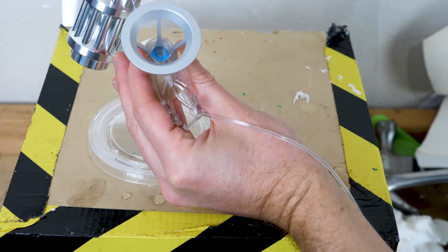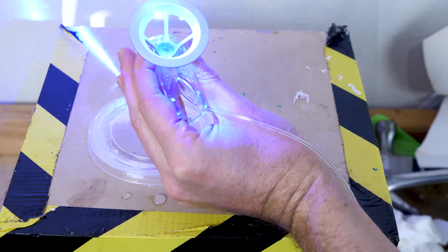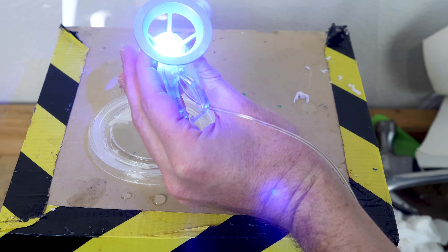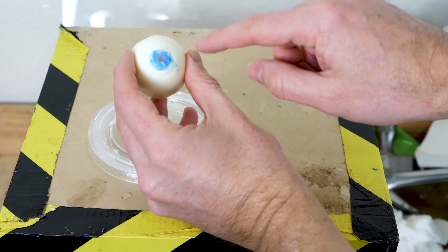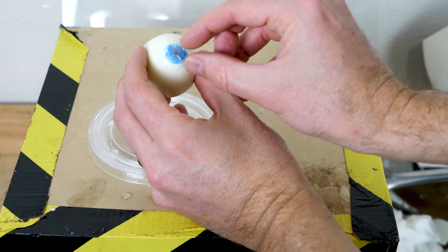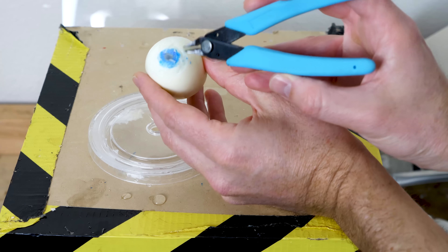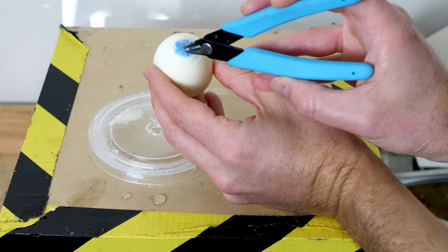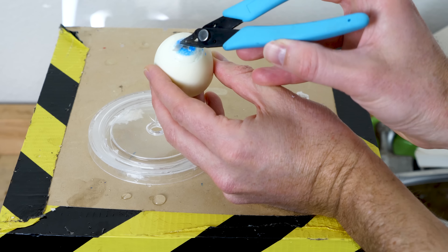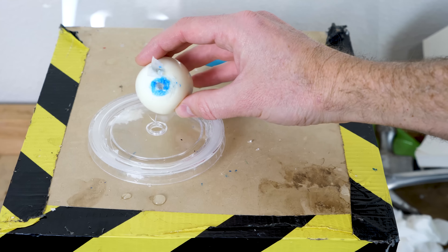Let's create the corneal flap with my high strength laser here. Three, two, one. After they do that, the cornea is now foggy because there's a layer of gas between there. Then the surgeon comes in and grabs that flap with a tool and peels it up. Now this is the part that actually shapes your cornea.